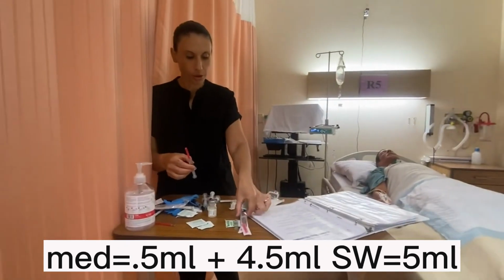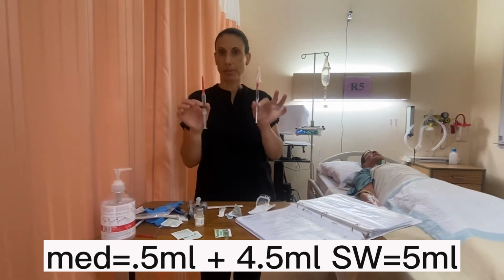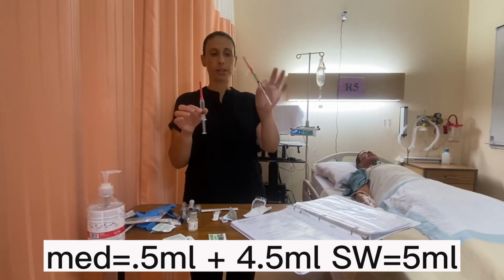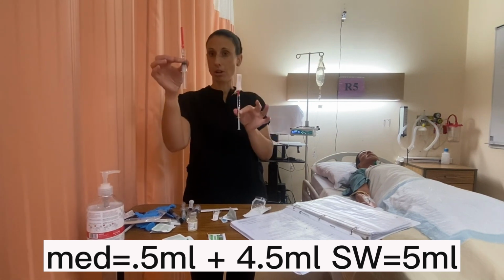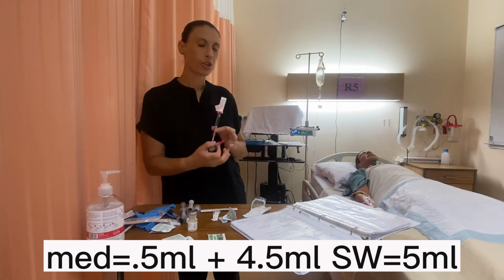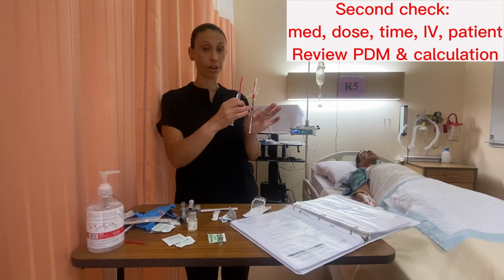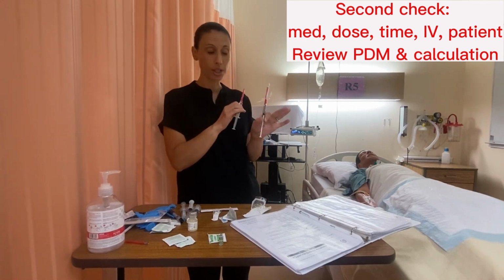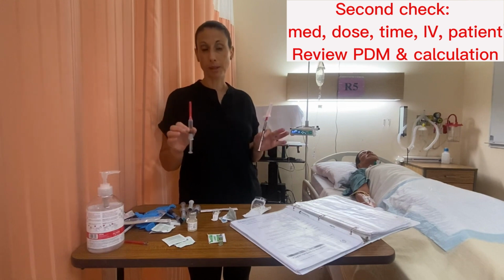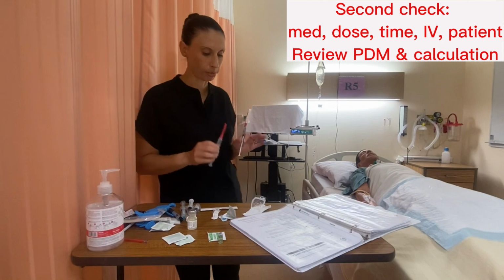Okay, and now we have 2 syringes. So one with my sterile water and also one with our medication of morphine. So now we're going to end up instilling this syringe into the larger syringe. So we're going to mix the medications. However, before we mix, just like with a mini bag, we're going to do our second check, because if we've made any errors in calculating our dosage, we want to know now before we mix it. Once we mix it, if we've made a mistake, we've got to throw it out and start all over. So this is a good time to check our mistakes.